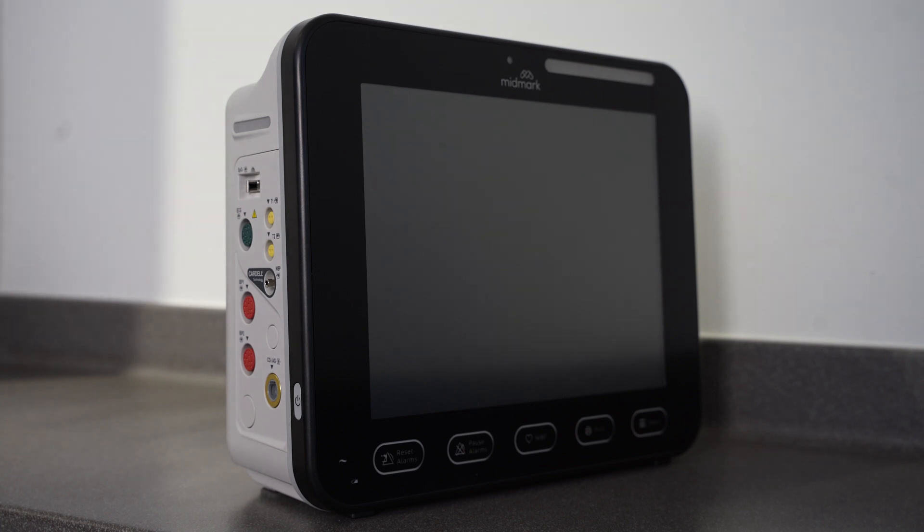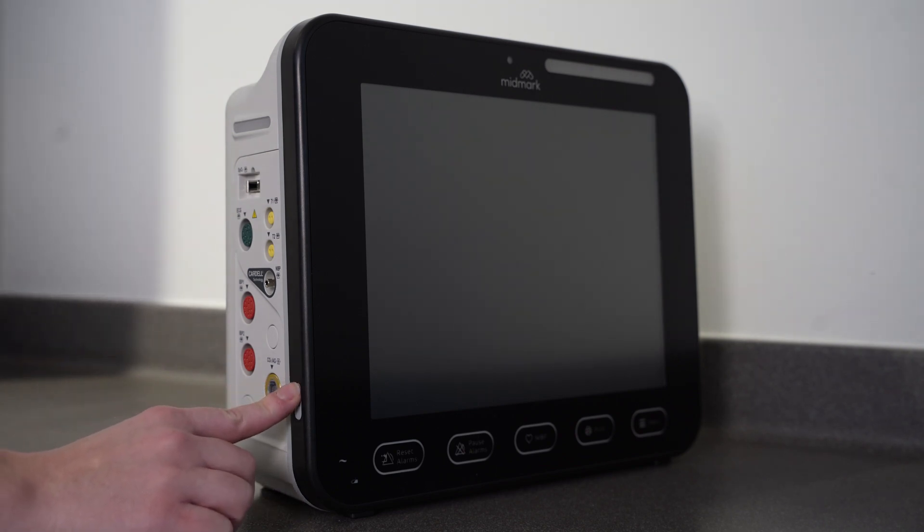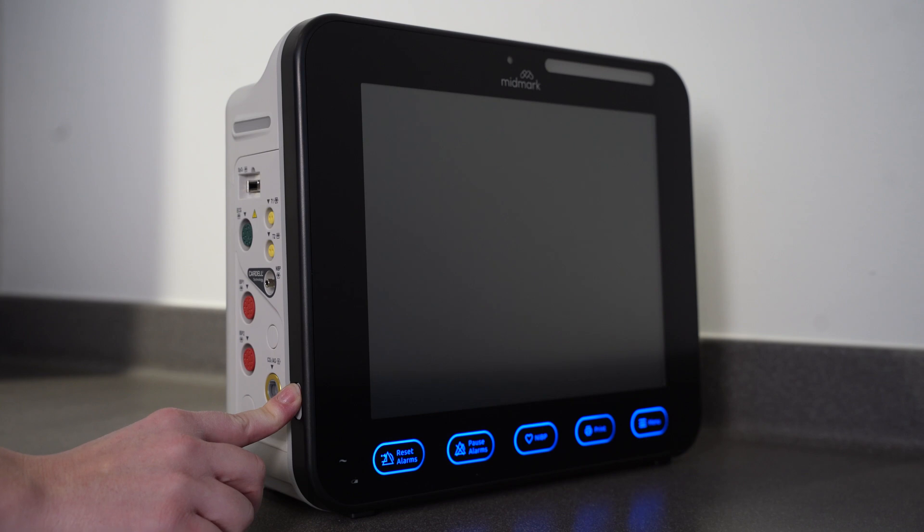To turn on the monitor, locate the power button on the left side of the monitor and press it.